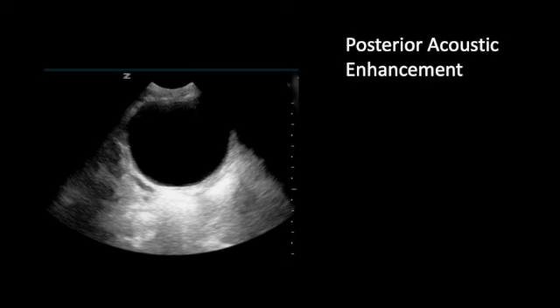The first ultrasound artifact I want you to be familiar with is called posterior acoustic enhancement. This occurs when there's less attenuation of the ultrasound beams than we normally would expect. This occurs because sometimes structures, usually fluid-filled sacs like the bladder in this case, transmit sound waves more easily than other structures do. And because less energy is lost in the process, more energy gets transmitted and thus echoed back. Now, this is not about the speed of passage of the sound, but rather the relative amount of energy that's passed. So higher amounts of energy getting through that structure means higher amounts of energy able to be reflected and causing echoes.